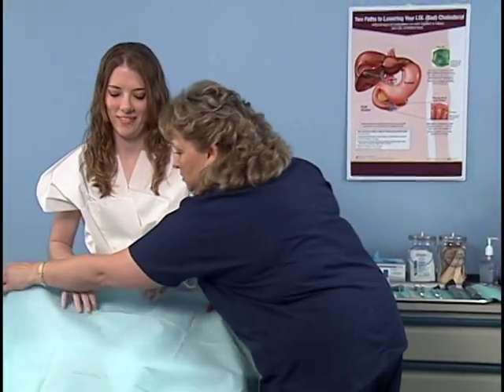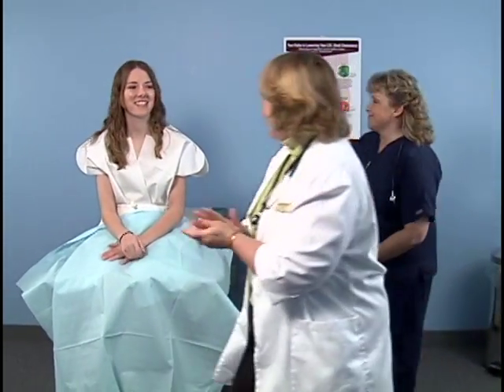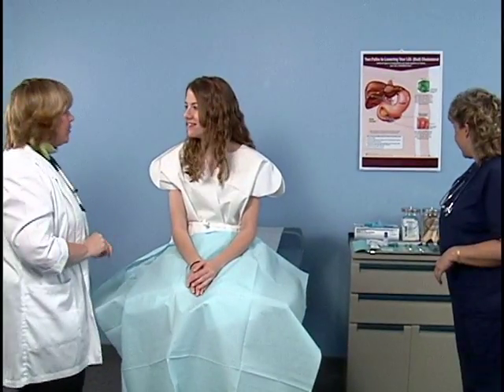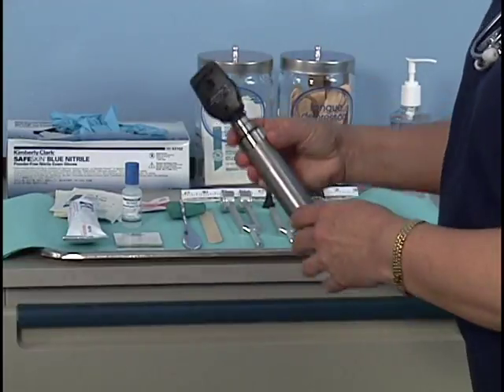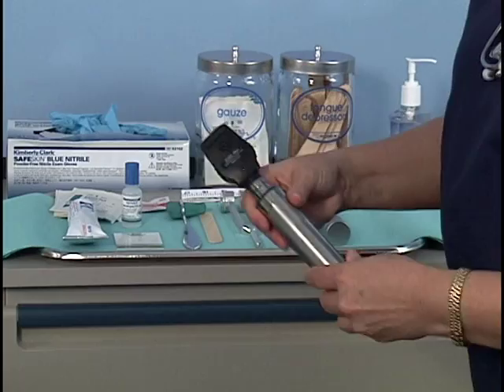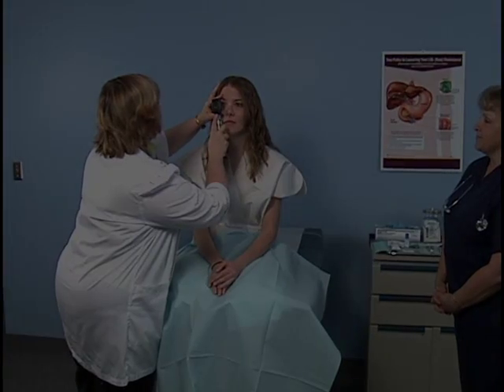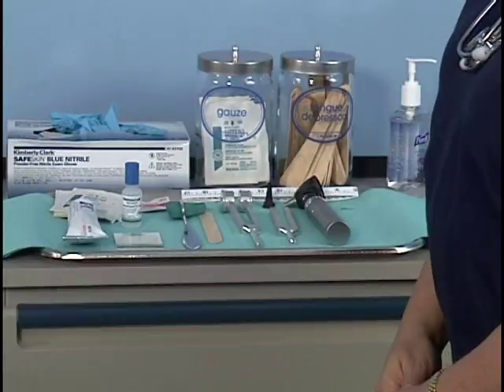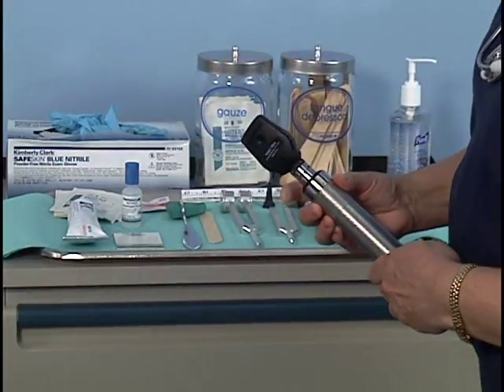Assist the physician with the examination of the body systems. Begin by making sure the patient is correctly positioned in a sitting position on the examining table. Place a drape over the patient's thighs and knees to provide warmth and modesty. Prepare the ophthalmoscope by turning it on. Hand the physician the ophthalmoscope and dim the light when the physician is ready to examine the eye. The dim light helps to dilate the patient's pupils so the physician can better see the interior of the eye.